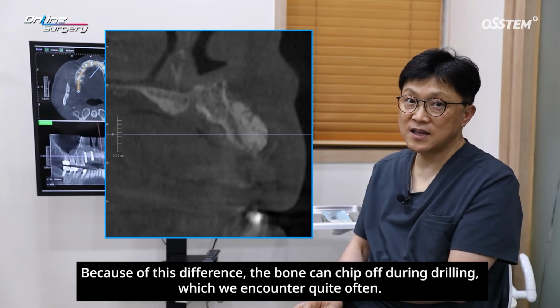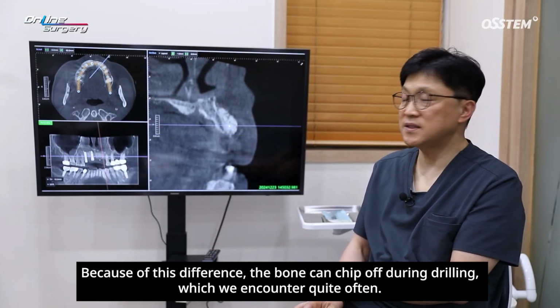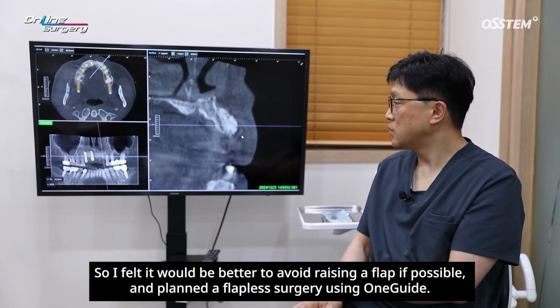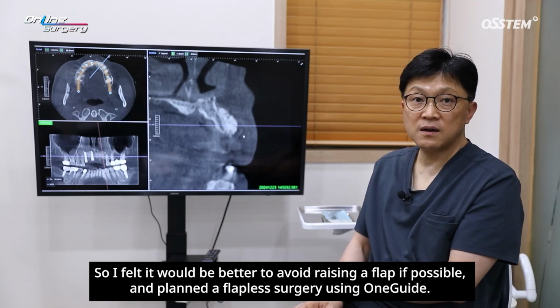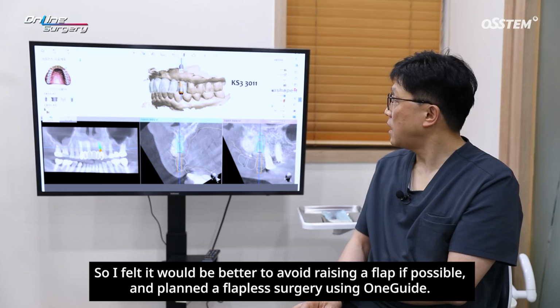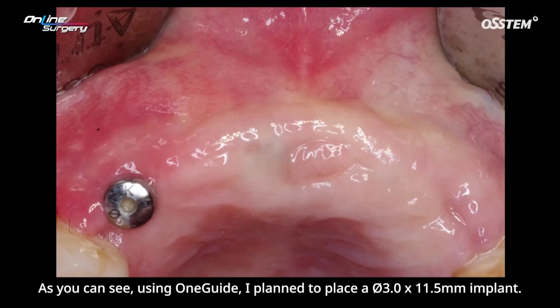Because of this difference, the bone can chip off during drilling, which we encounter quite often. So I felt it would be better to avoid raising a flap if possible, and planned a flapless surgery using OneGuide. As you can see, using OneGuide, I plan to place a 3.0 by 11.5 millimeter implant.